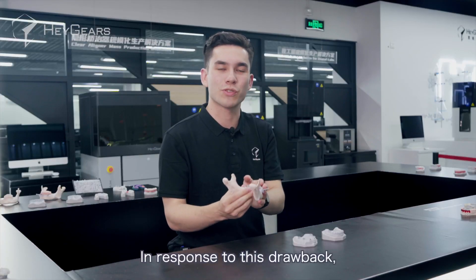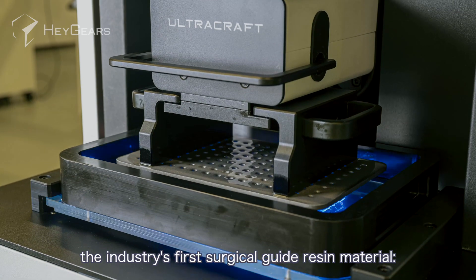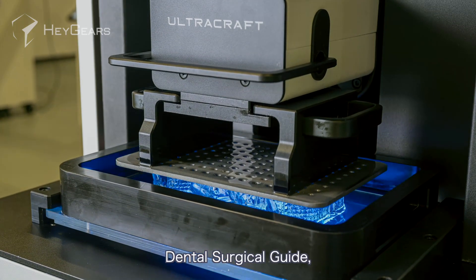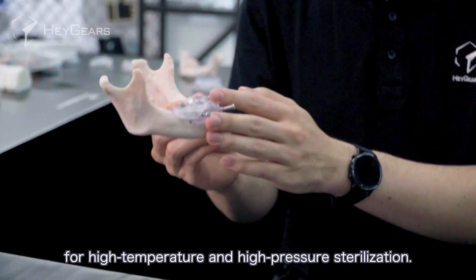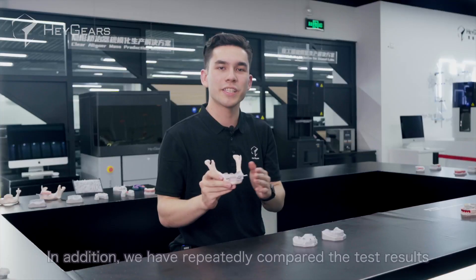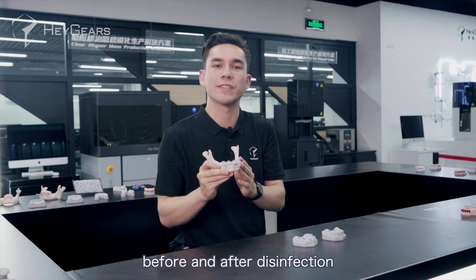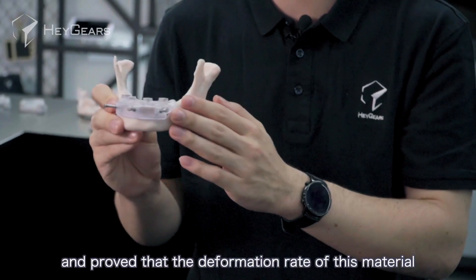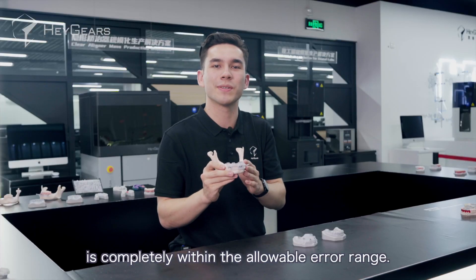In response to this drawback, HeyGears pioneered the industry's first surgical guide resin material, Dental Surgical Guide — a material that can be used for high temperature and high pressure sterilization. We have repeatedly compared test results before and after disinfection, and proved that the deformation rate of this material is completely within the allowable error range.